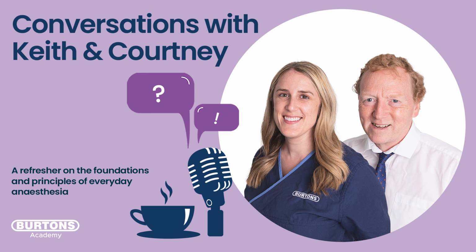An oxygen analyzer, not on a breath-to-breath basis as part of a multi-parameter, but just standalone oxygen measurement, just to measure the incoming oxygen, the FiO2 to the patient. Put it on the outlet from the circle, put it on the fresh gas outlet from an anesthetic machine, just so you can see that it says 90%, 93%, or whatever it would be.